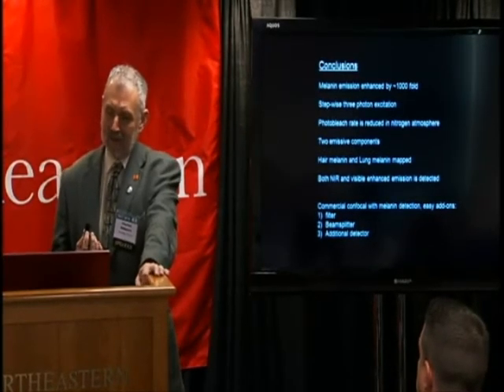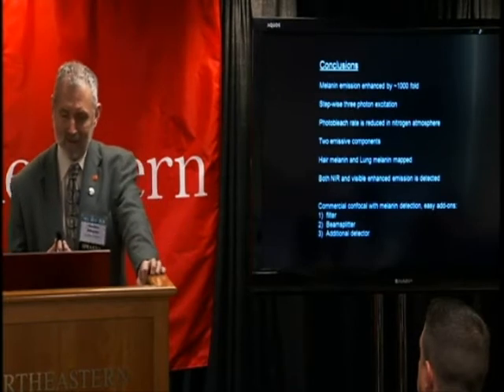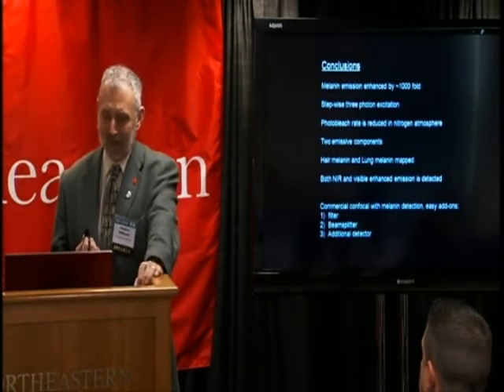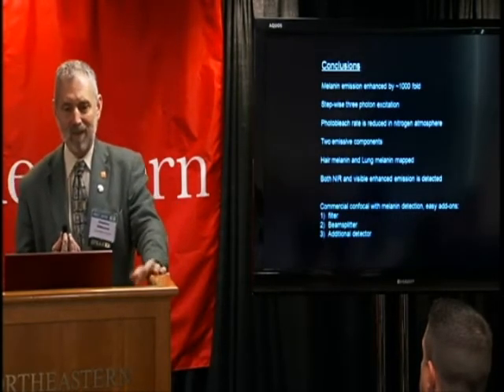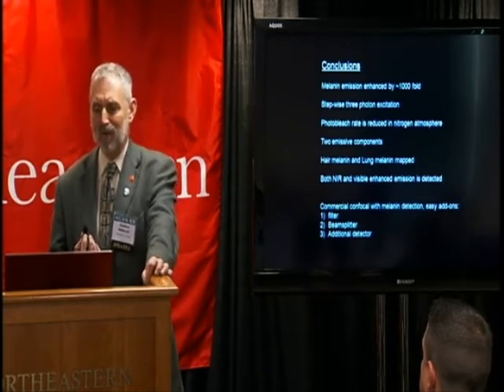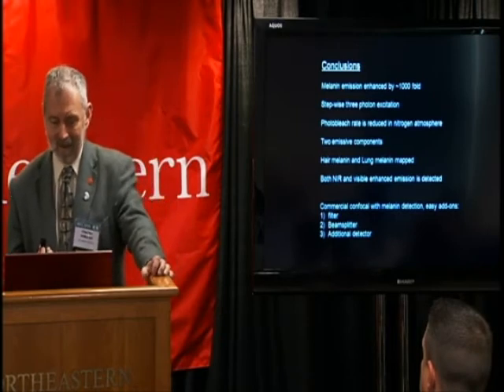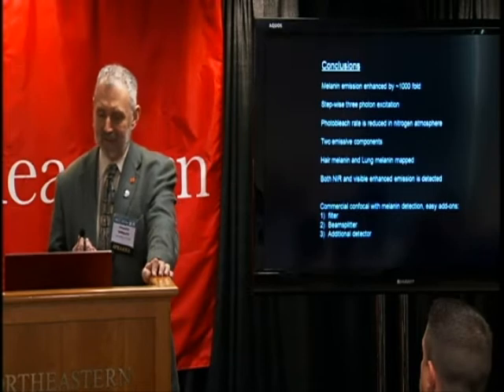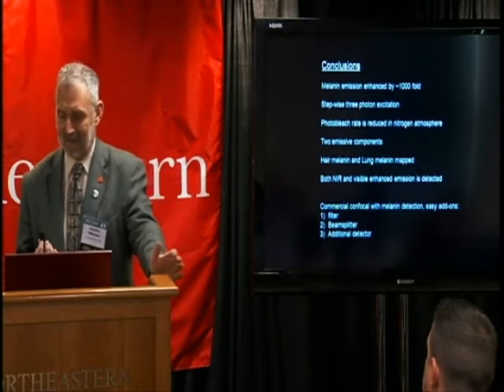And we also detect the near-IR fluorescence in addition to the visible fluorescence, but it is indeed much weaker. The real significance of this work for the present talk is that this technology could, because it's a CW laser, this technology could easily be retrofitted onto a conventional confocal microscope with the addition of three components. A beam splitter to split off the visible light, a filter to remove the infrared, and an additional detector.